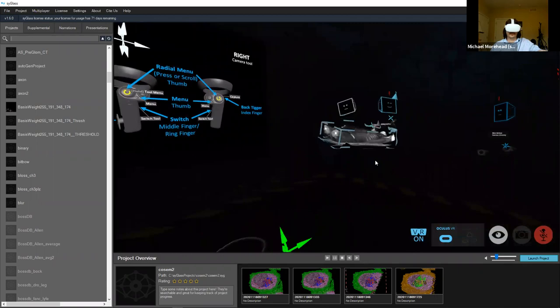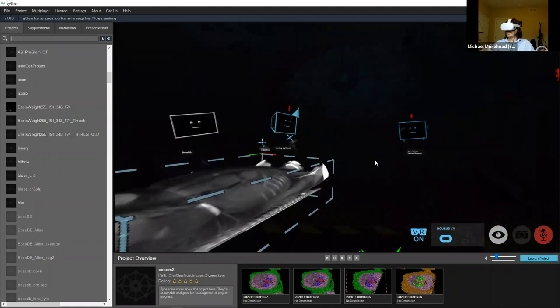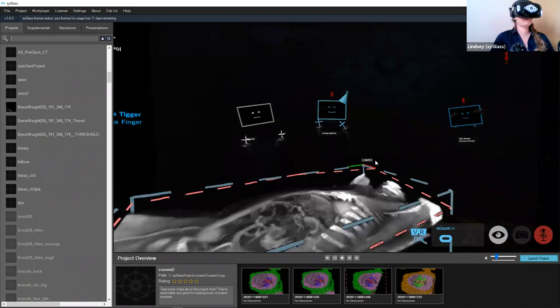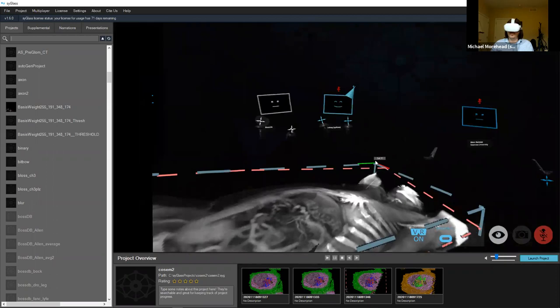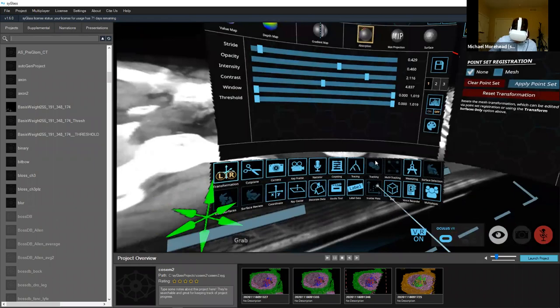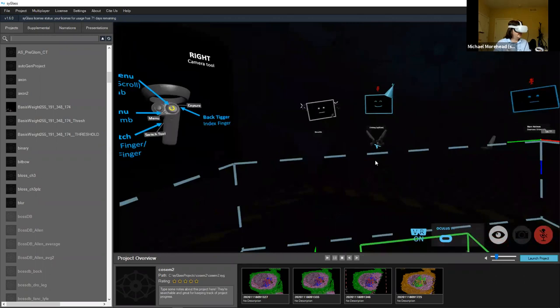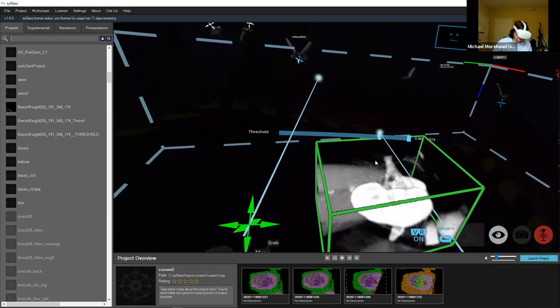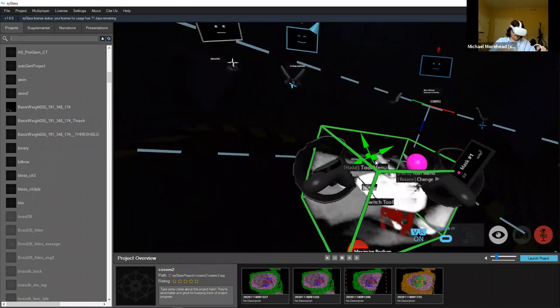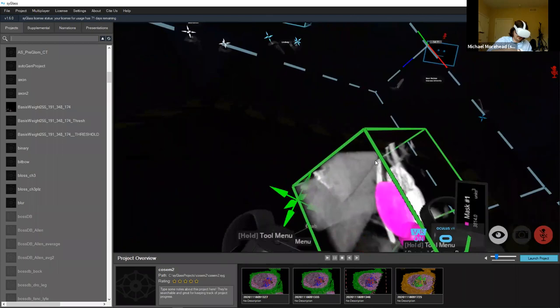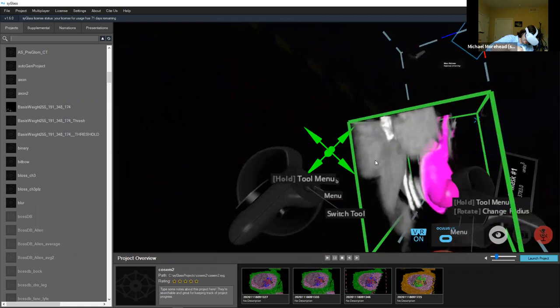We're in the VR space together now. The ROI tool and painting tools come through over the internet so you should be able to see this box I'm placing around the kidney. This is a special case in segmentation where the object you want to segment is surrounded by darker voxels — easy to threshold things away, so you can just paint the whole thing without worrying about going outside the lines. That's the easiest case.